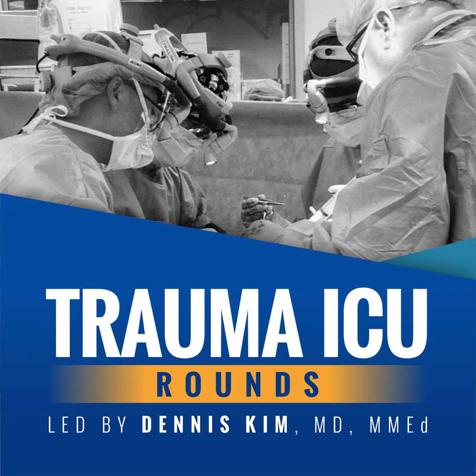So for those who are deemed not ready for an SBT, we need to search for, identify, and reverse all possible ventilatory as well as non-ventilatory issues, and this should be an integral part of the ventilator discontinuation process. Now, what specific criteria should we look towards to say that, yes, our patient is ready to perform an SBT? An international consensus conference on weaning emphasized that the first weaning trial should be considered ideally within the first 24 hours or after the first 24 hours.